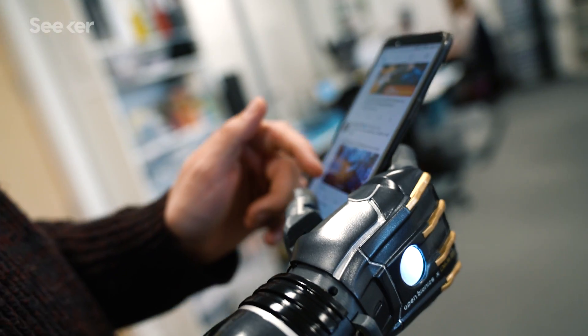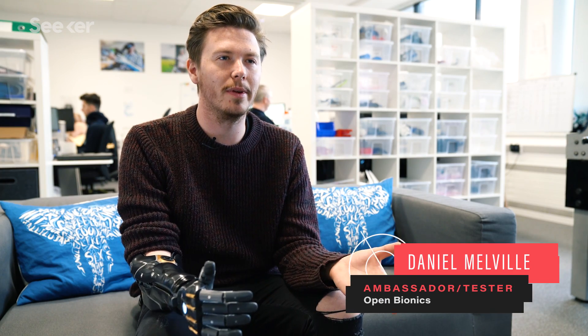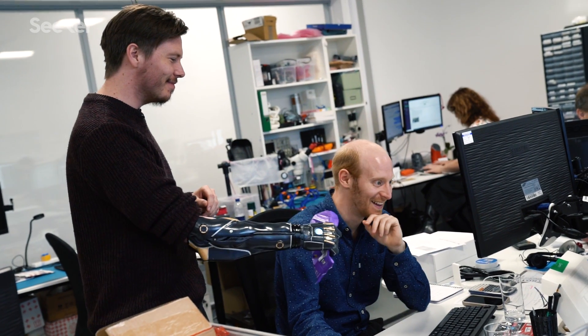I didn't think this kind of technology would be possible, especially at low cost. It's just crazy what I can do with the arm compared to three years ago — and even back then that was still mad.